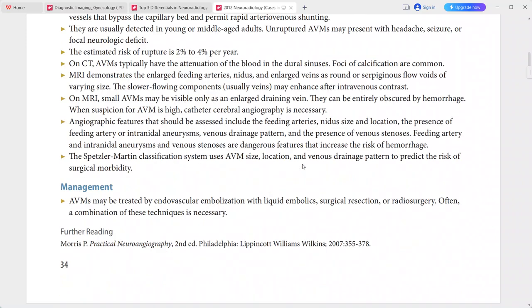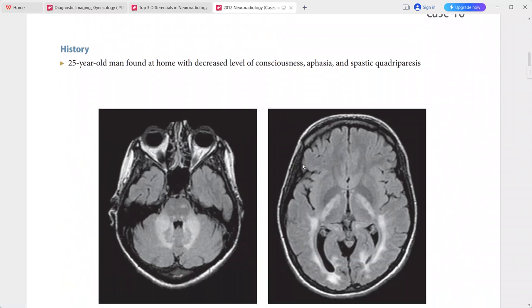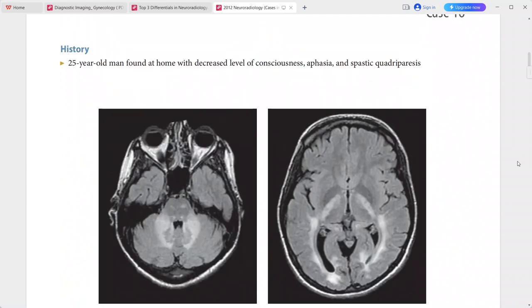Next case: 25-year-old man found at home with decreased level of consciousness, aphasia, and spastic quadriparesis. FLAIR sequences show hyperintense signal throughout the centrum semiovale.